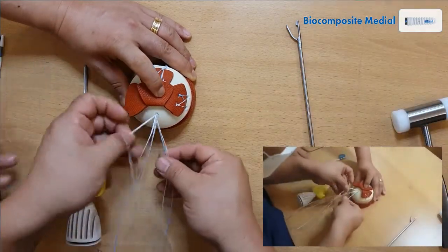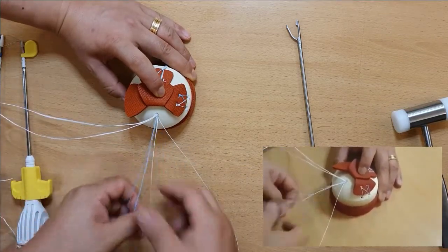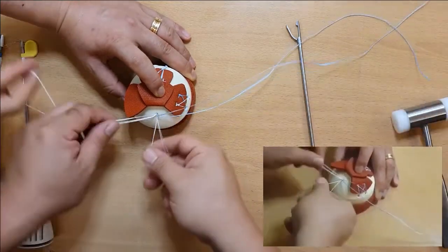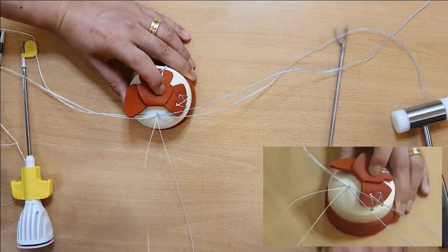Now we have two fiber wires, white and a blue one. And this is fiber tape and we have one fiber wire. I'm going to pass this fiber wire.